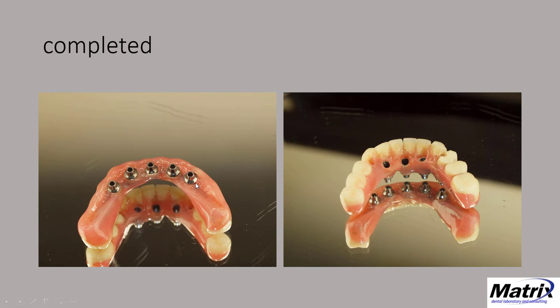Here's a completed case. I'm not going to fidget with this. I asked if I could clean it up and reshape and modify it, and I was told that he wasn't interested, and so okay, fine. I can only ask, and again, I cannot warranty this repair because there are certain conditions which will prevent me from warrantying it. And the other thing I should probably mention is I don't warranty other people's work. A repair is to fix something that was wrong to begin with, usually, and I'm not going to embrace somebody else's work and have an endless stream of repairs on somebody else's work.